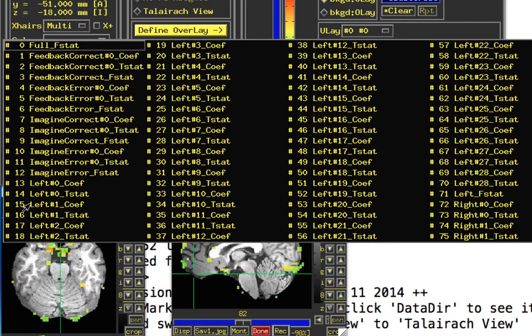The ones I'm interested in — the actual beta weights — are these coefs. There's a t-stat and a coef; the coef is the actual beta weight. Those go from sub-brick 15 up until 69.